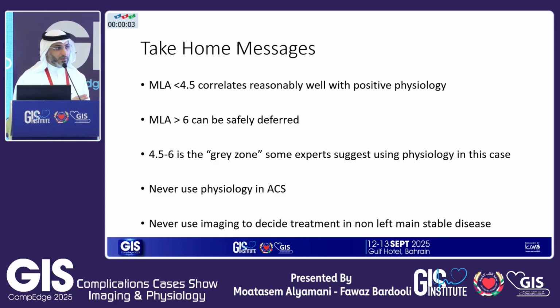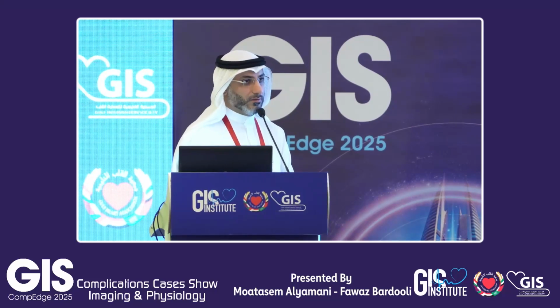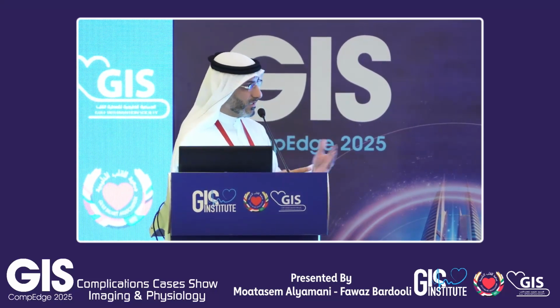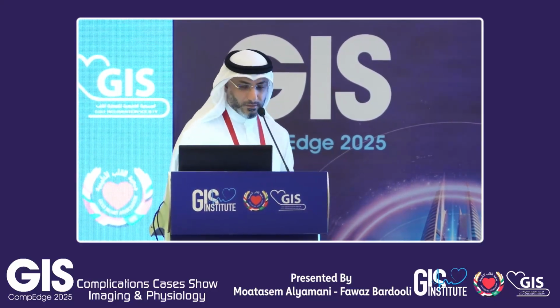You should never use physiology in ACS, as we mentioned. And this last comment might also change with the studies that just came from South Korea that correlate physiology with imaging outside the left main, so this might change in the future. But as for now, it's class 3 to use imaging outside the left main to decide treatment.